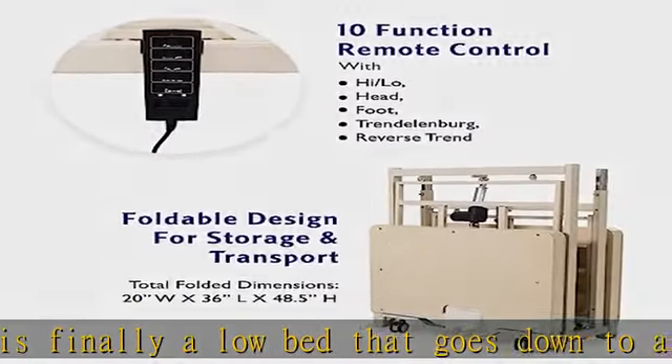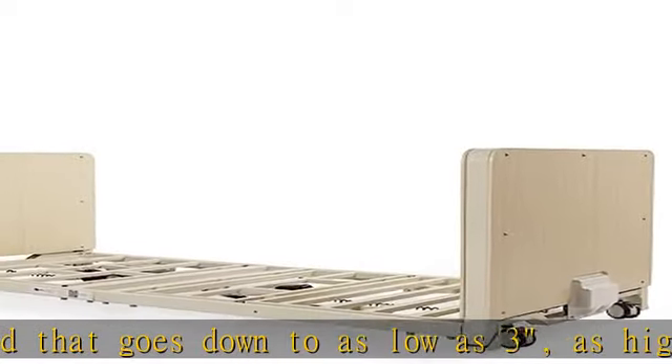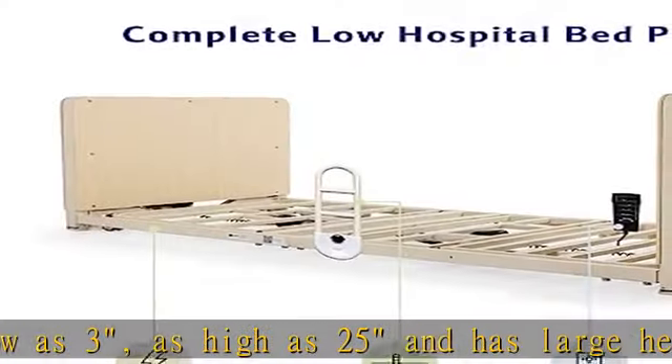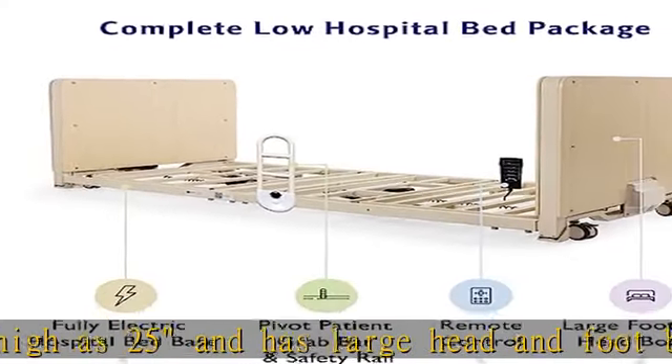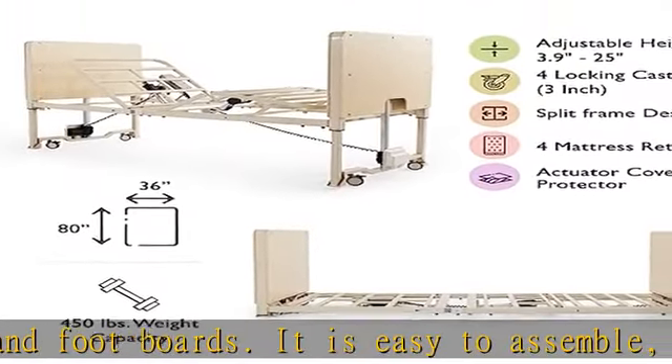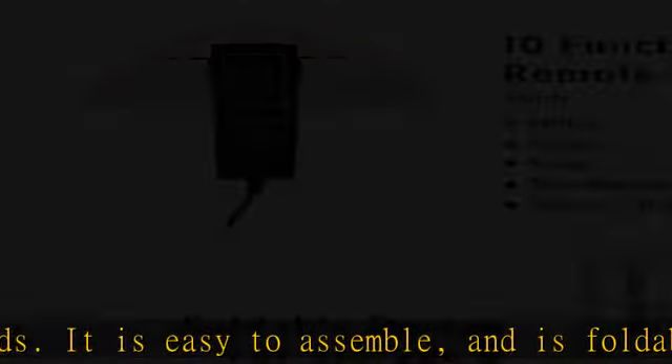Portability and transportation. Full bed package — this fully electric motorized hospital bed includes everything you need, including the adjustable bed frame, 4x3 locking casters and wheels, a large button remote controller, and a pair of pivot patient assist bar safety rails.